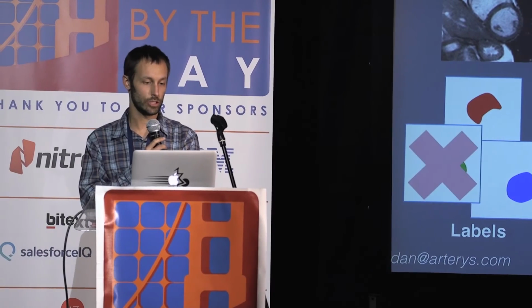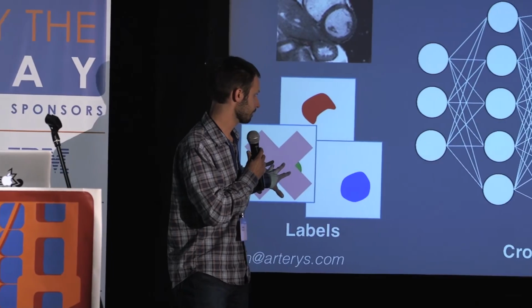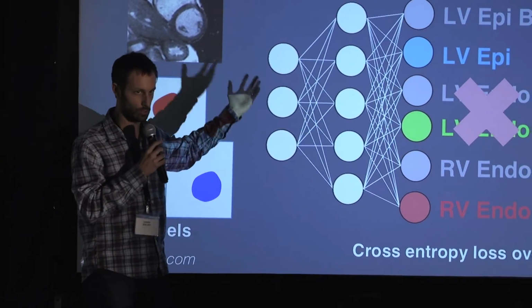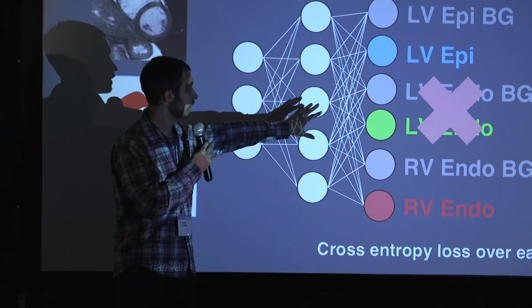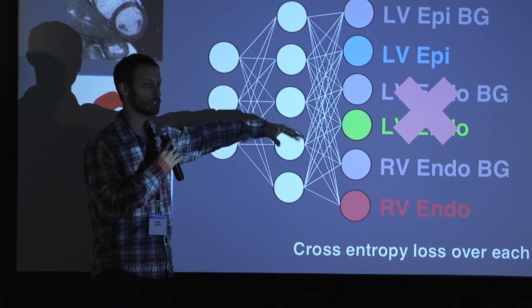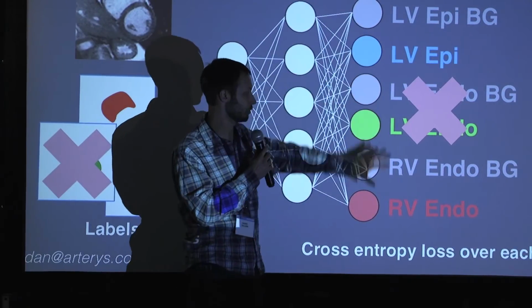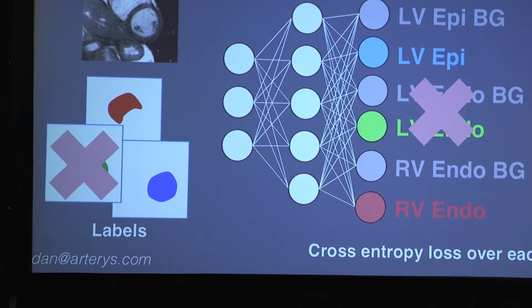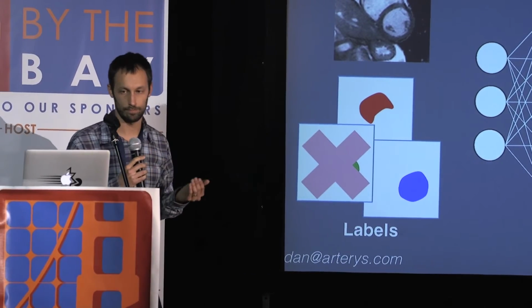And the key advantage here is that if a given image is missing one of those 3 classes, we simply ignore that component of the loss. When doing training, the network will still make predictions for a given training batch, even on a label for which we do not have a ground truth mask, but we will simply discard those predictions when calculating the total loss, sum the loss from the 2 classes that we do have ground truth on and backpropagate that. And in doing that, every image that has at least 1 ground truth contour can be used in the training process.